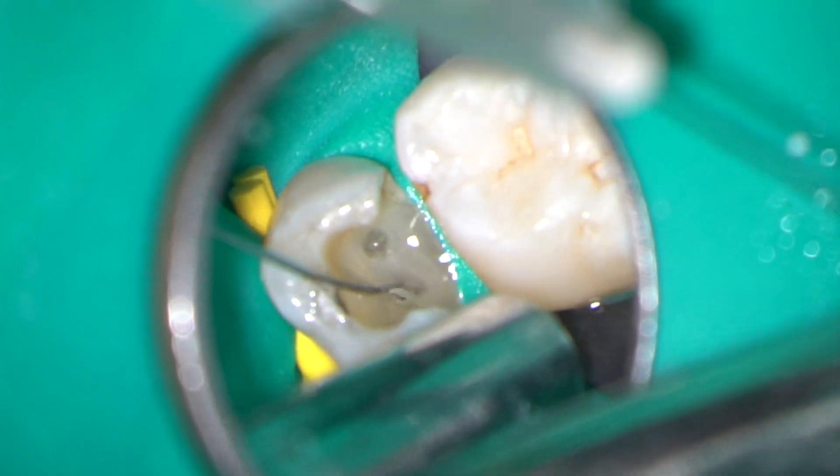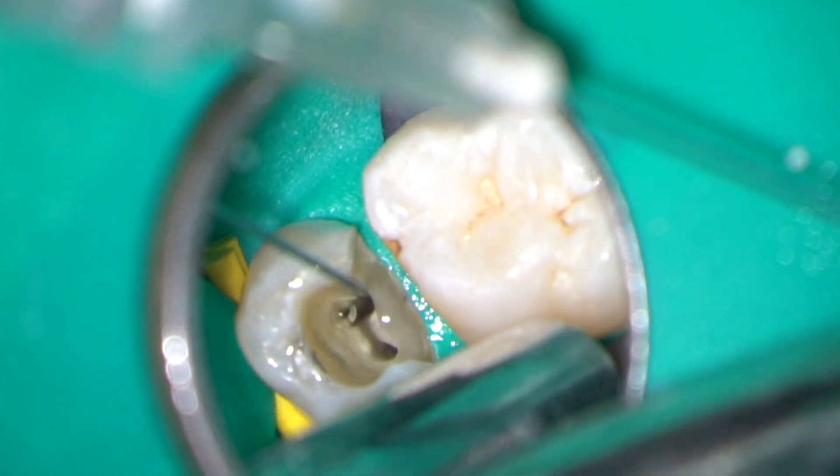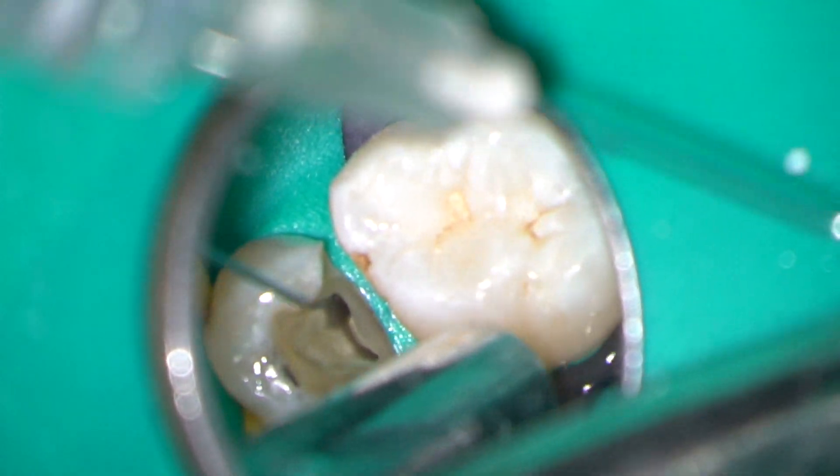After final irrigation with 3% sodium hypochlorite, the canals were dried with sterile paper points and then obturated using a vertically compacted gutta-percha technique.